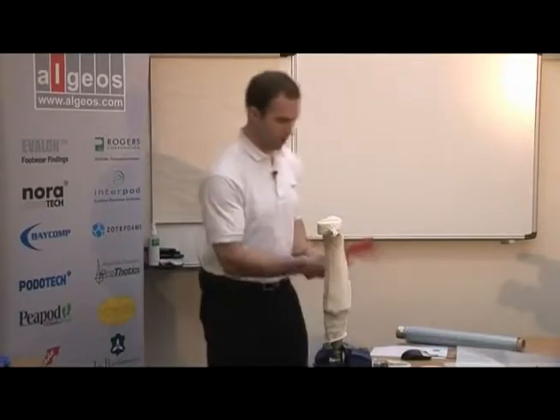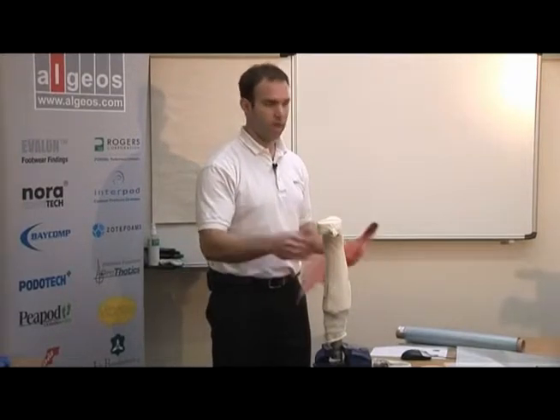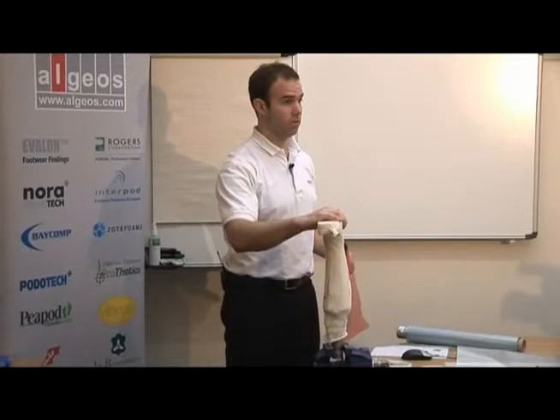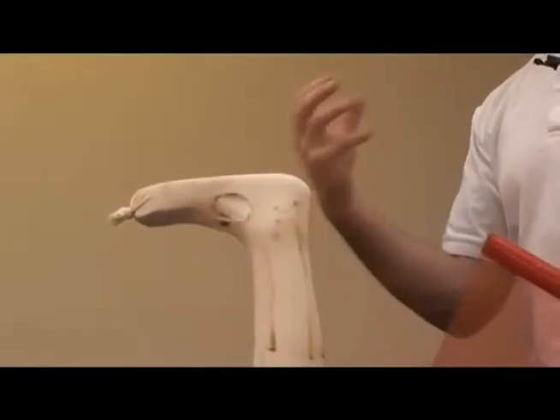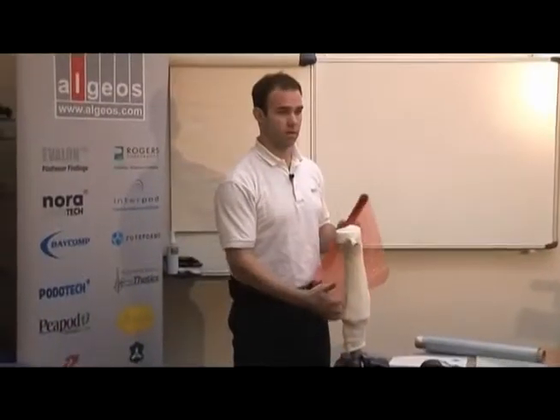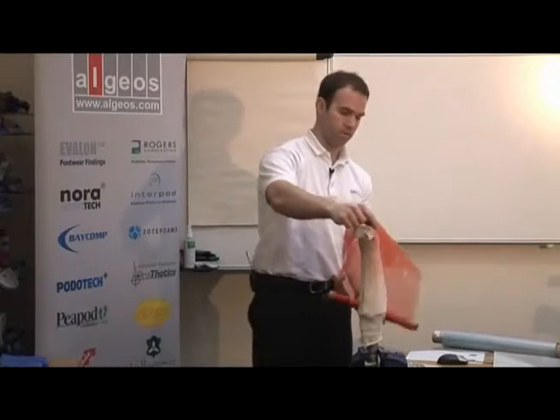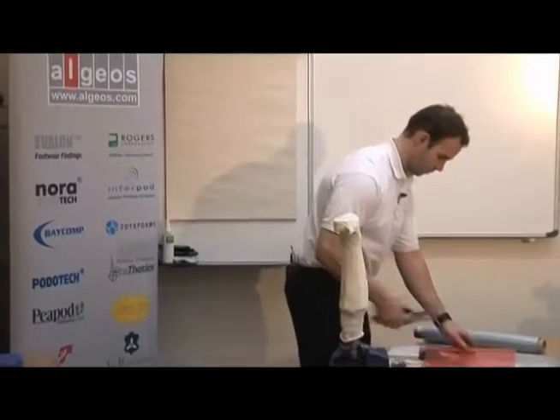Now I've prepared the mold. We use a release film because it's important to have a barrier between the plaster mold and the carbon. We don't want any moisture from the plaster mold getting into the matrix, as that will oxidize the matrix. So it's important to have a release film between the material and the plaster.